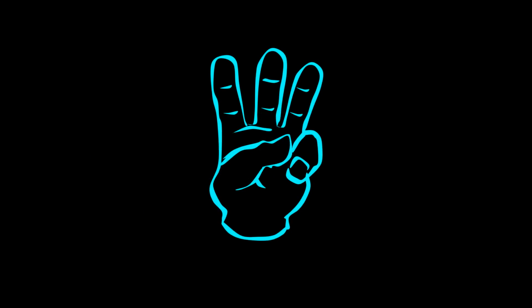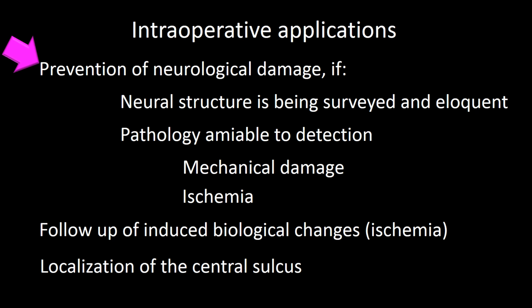Intraoperative somatosensory evoked potential has three main applications. The first one, and probably the most important one, is the prevention of neurological damage by alerting the surgeon of impending doom.